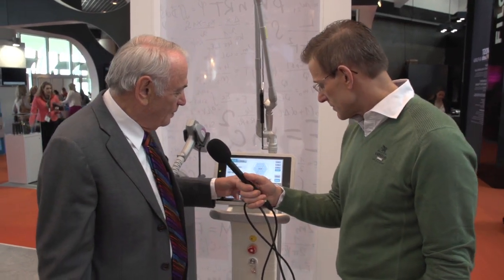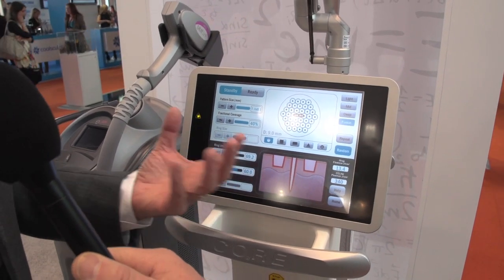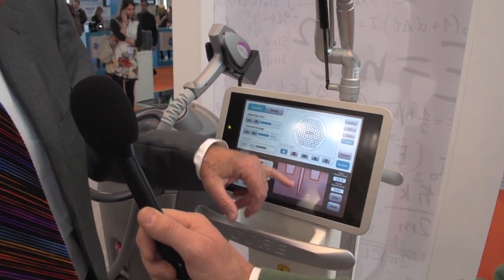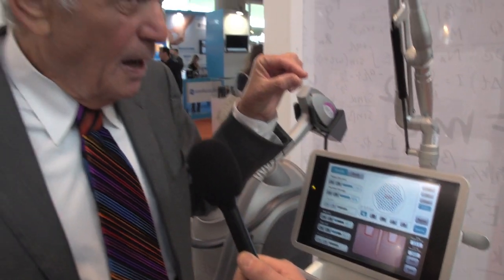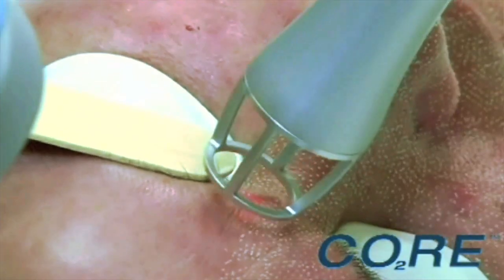How deep does the laser penetrate the skin? In principle you can control it, but typically we penetrate about 0.5 millimeter into the skin. We go through the epidermis, the upper layer of the skin, and do most of the work in the dermis itself. What you can see, for example, in this pattern here, which is the computer that controls this laser, is that you create both very narrow holes that go deeper into the dermis, but you also ablate the upper layer of the epidermis, which is the upper layer of the skin.